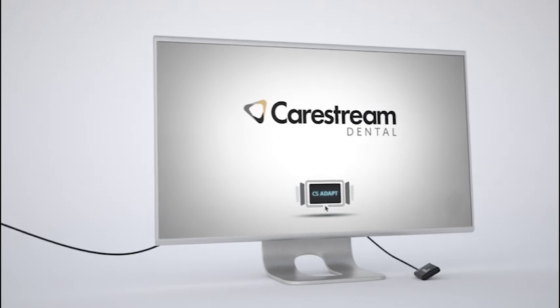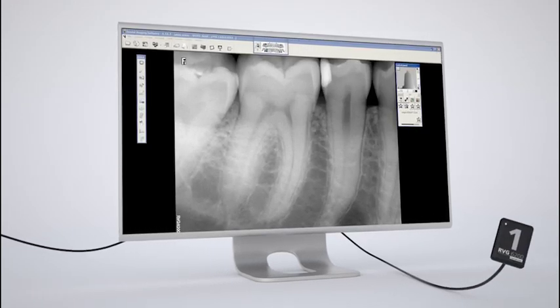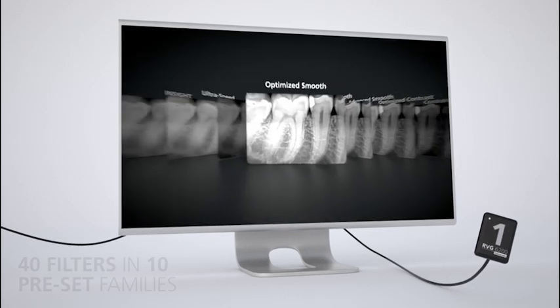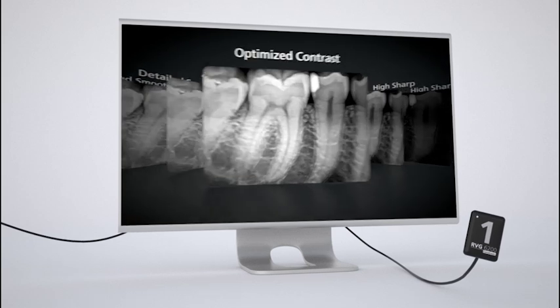The CS Adapt module lets you choose the look and feel of your images. Just point and click to select a filter in the imaging software. Ten preset filter families and four favorites of your own allow you to diagnose in the way you do best.